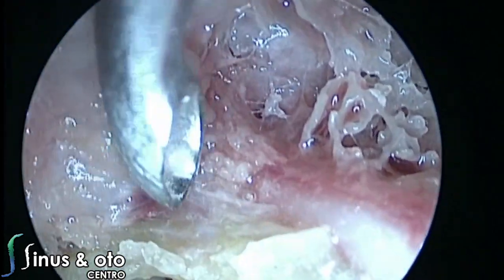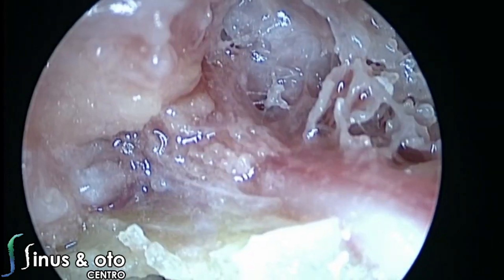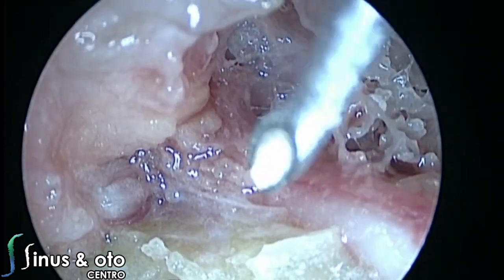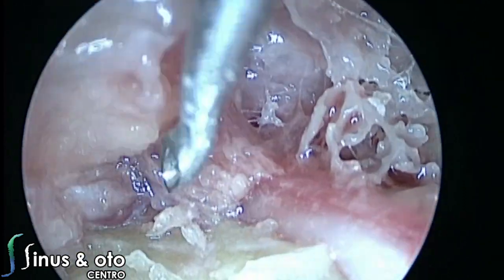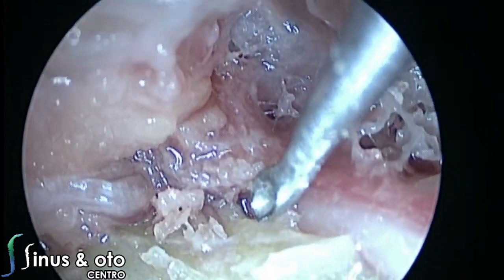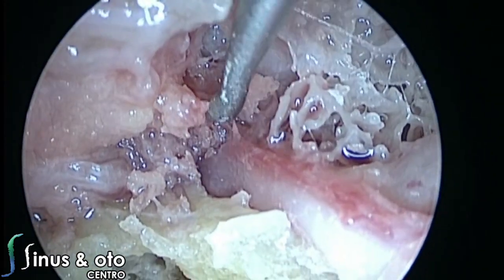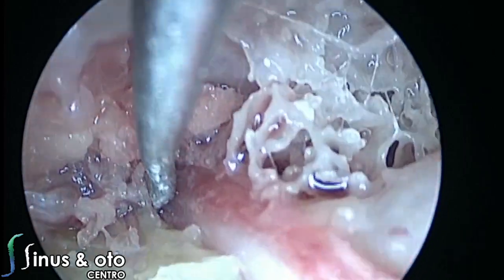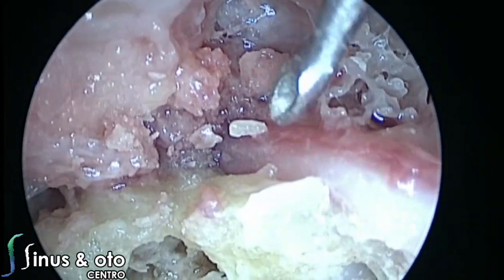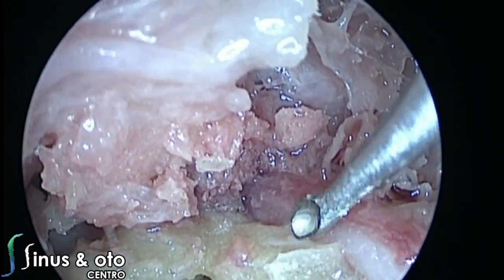So the geniculate ganglion also is the landmark, the place from which the greater petrosal superficial nerve goes, following the muscle and following the eustachian tube, because this muscle follows the eustachian tube. So we curette a little bit more anteriorly and inferiorly in the direction of the muscle to try to see the greater petrosal superficial nerve. Once we use the curette, we are elevating the bone over there, trying to see the geniculate ganglion in a better way, in a better position.